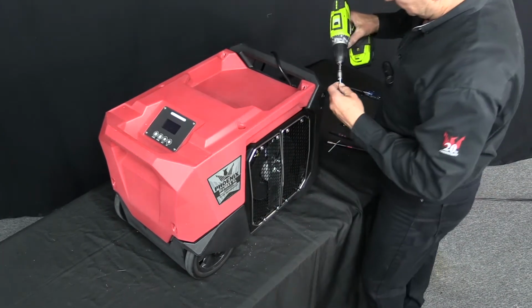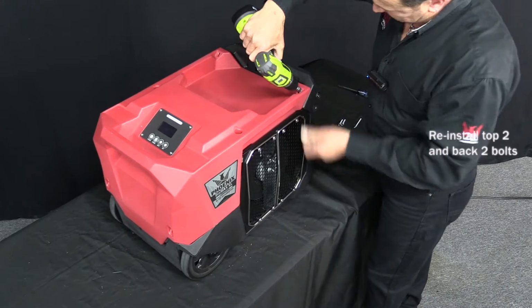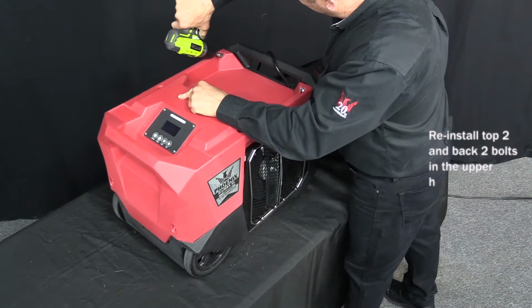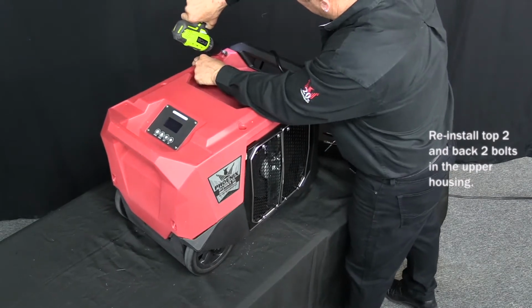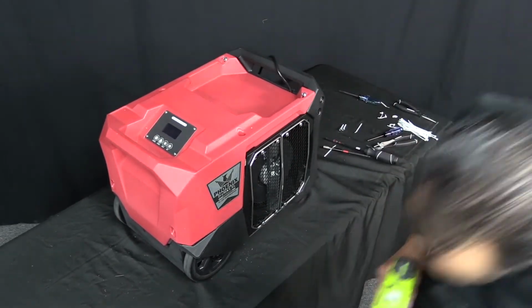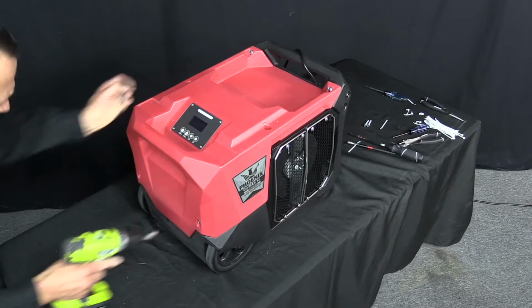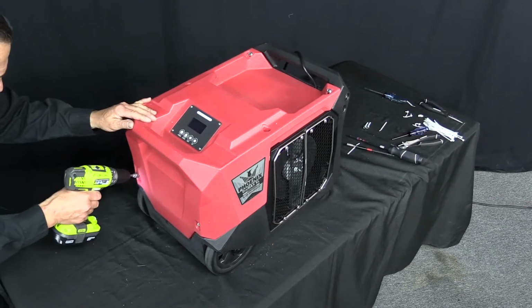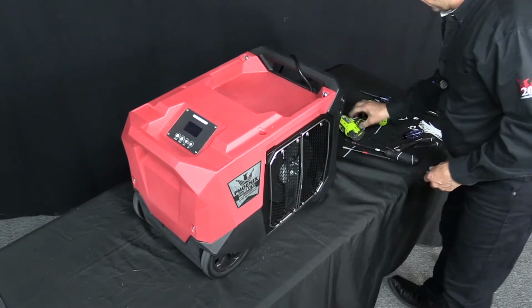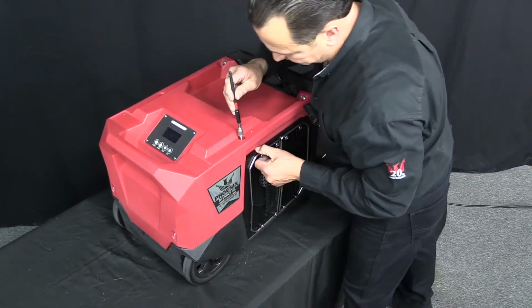Now, once that's done, we'll install the first 4 bolts minus the 2 middle ones. Tighten those up. Tighten up the 2 on the back. And finally, reinstall the last 2 bolts for the upper housing.